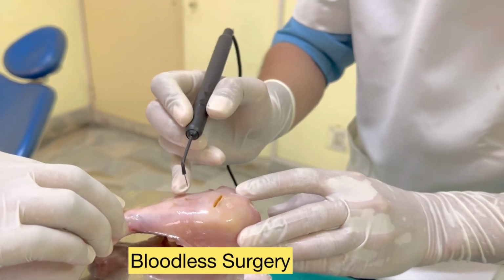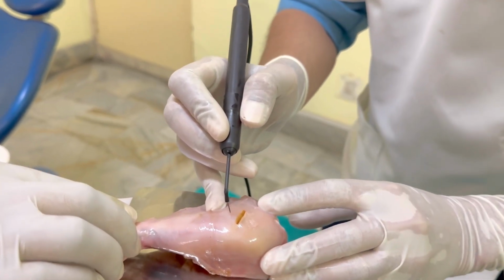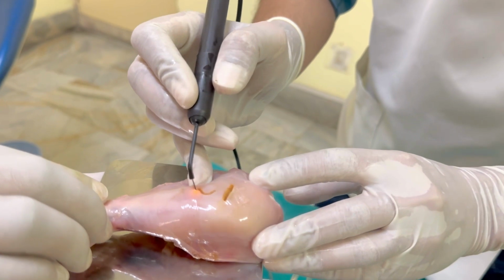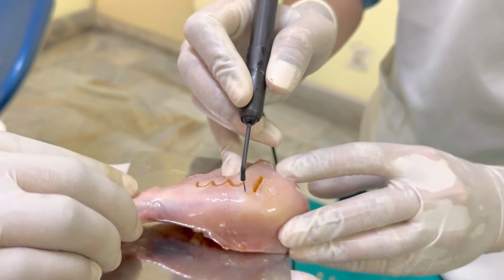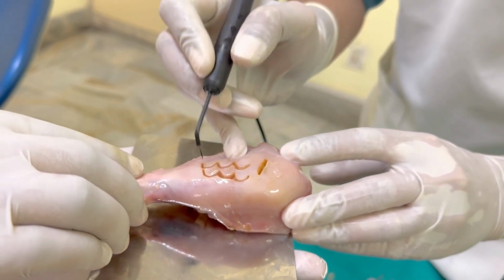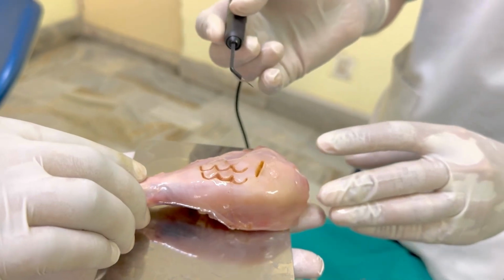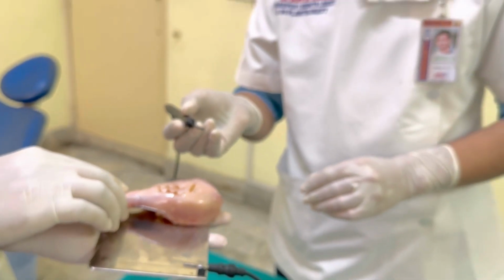Suppose I want to do a case of aesthetic crown lengthening, that is gummy smile correction, I can easily use it like this. So can you see? On the whole, beautiful scalloping can be given with the use of electrosurgery. So electrosurgery is a beautiful modality, quite economical, which can be used for incision.